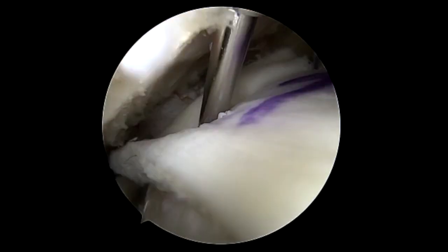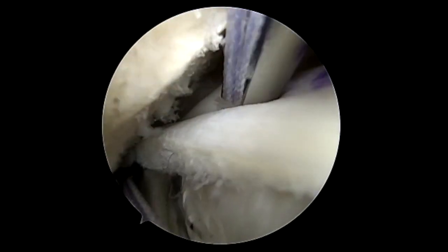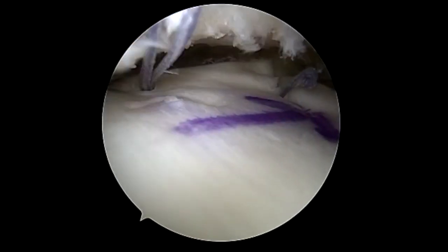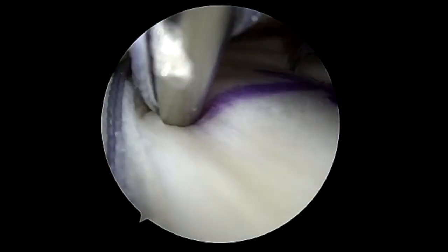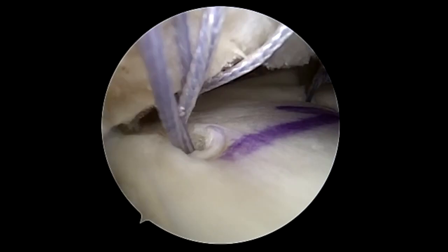The nice thing about these fiber stitches is that because of the acute angle, you're able to get underneath the acromion and get quite far medially to attach this patch. These can also be used for a two millimeter patch as well. In this case we had reasonable tissue so we decided to go with a one millimeter patch.